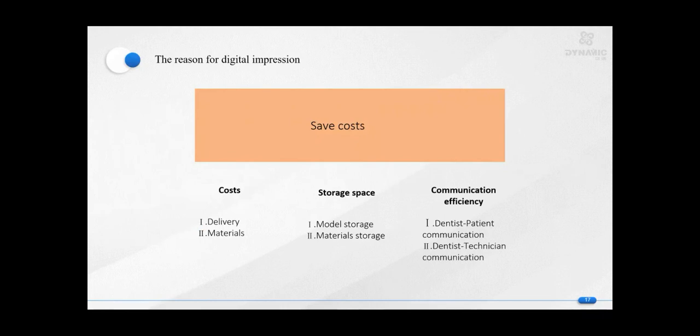The second is the storage space. In the traditional process, we have to store the patient's plaster model for a period of time due to the need of treatment.